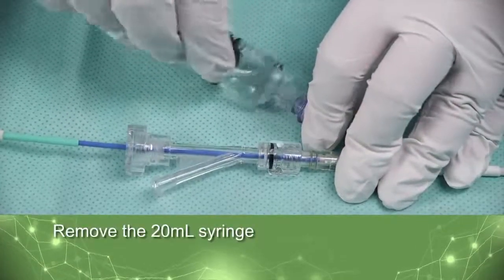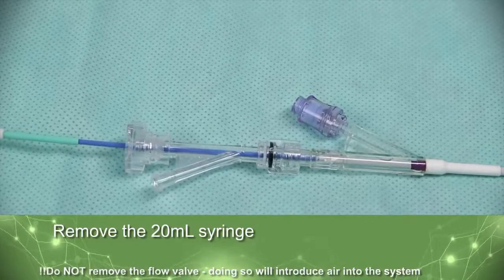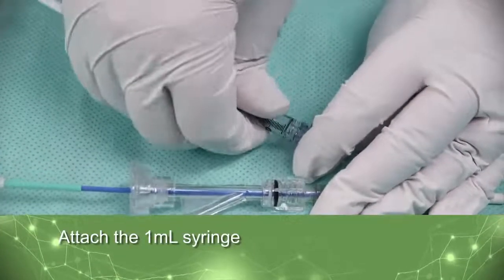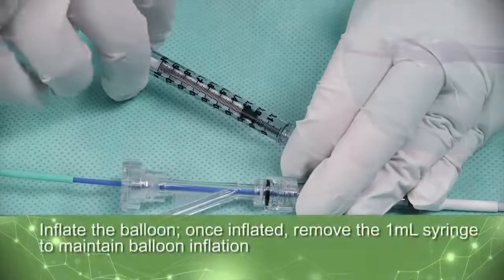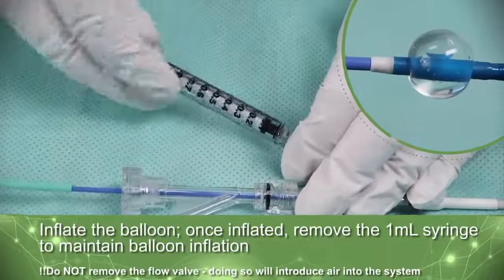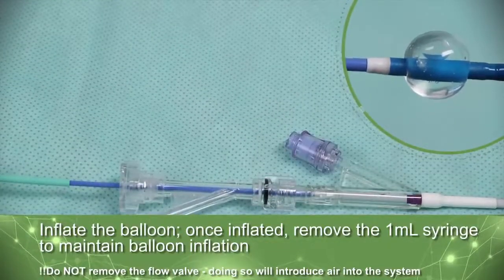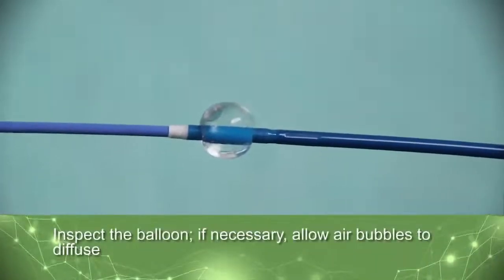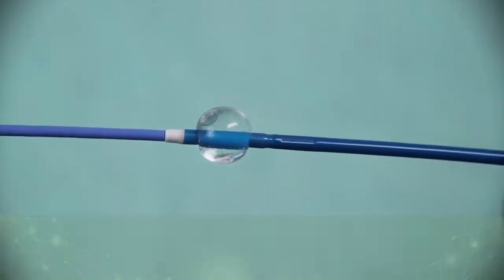Remove the 20-milliliter syringe, leaving the flow valve in place. Attach the 1-milliliter syringe to the flow valve. Inflate the balloon by infusing 0.6 milliliters of Inflation Media into the balloon. Once inflated, remove the 1-milliliter syringe to maintain balloon inflation. Inspect the balloon for leakage. If necessary, keep the balloon inflated in a sterile environment until air bubbles diffuse from the balloon.